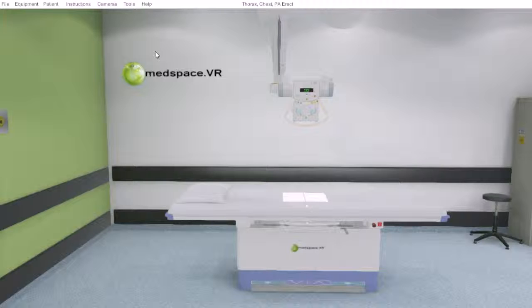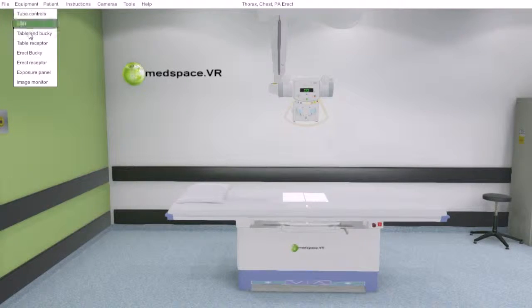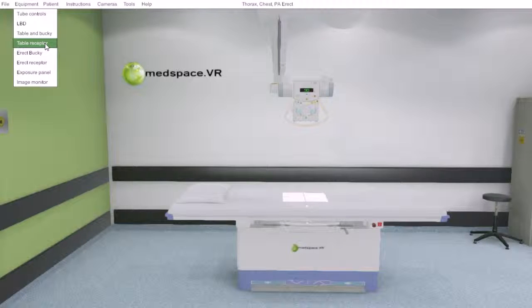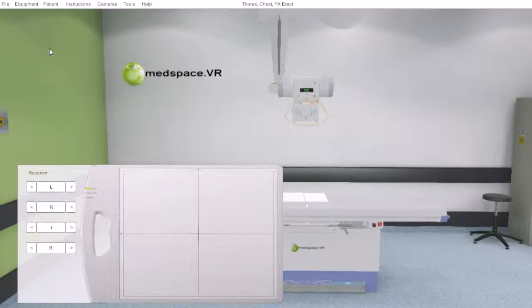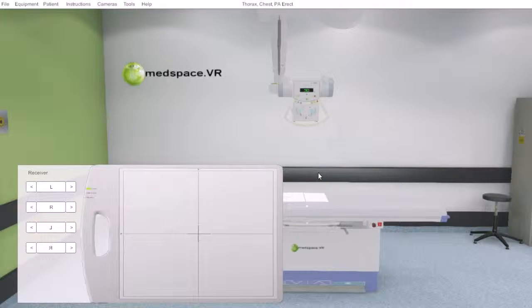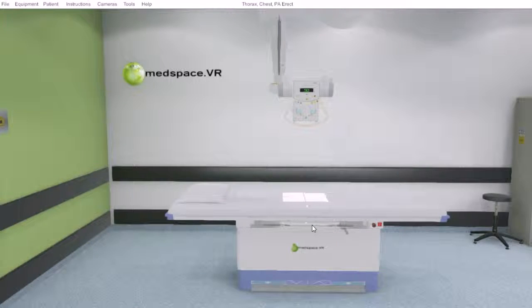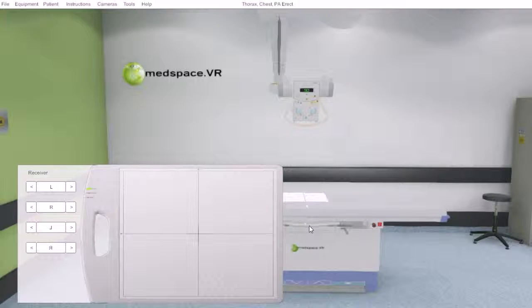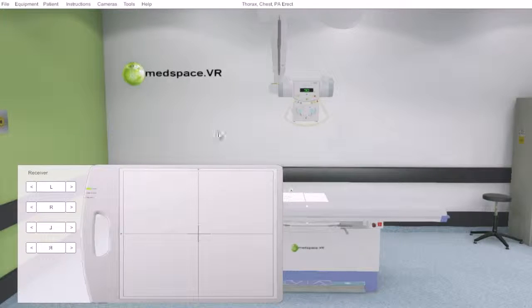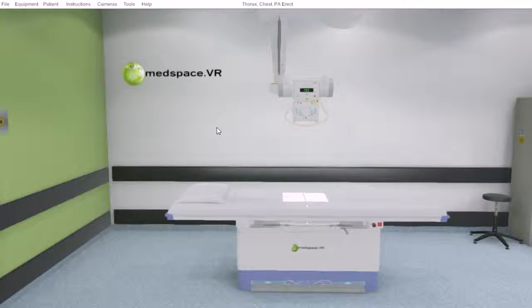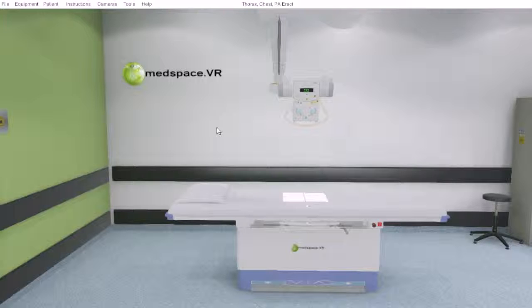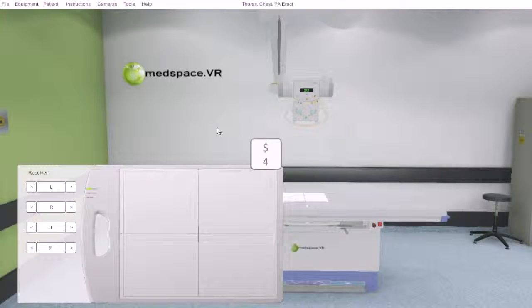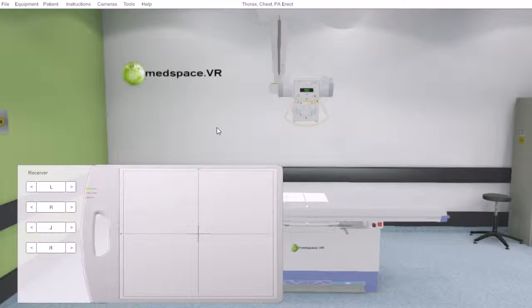To interact with the table detector, we come to our receptor on the drop down menu for the table, or we can actually select it by the left mouse button click. To deselect anything, left mouse somewhere it is not on the piece of equipment, or we have our shortcut key, numerical key 4 will allow access to that table receptor.